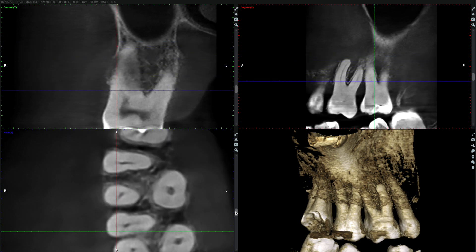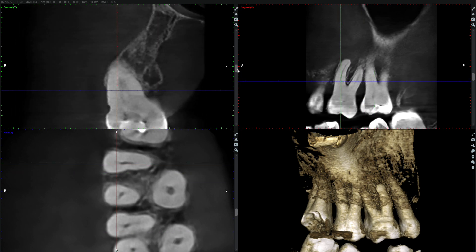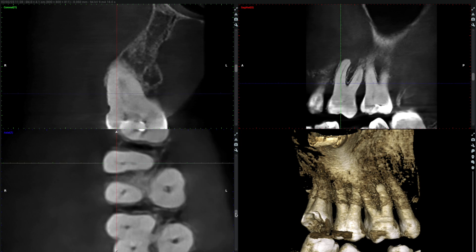Closer examination of the MB root reveals that there are two root canals. These converge in the coronal third and the orifices are quite close together. I'm going to bear this in mind when I'm troughing along the line between the MB and palatal roots hunting for that MB2 orifice.